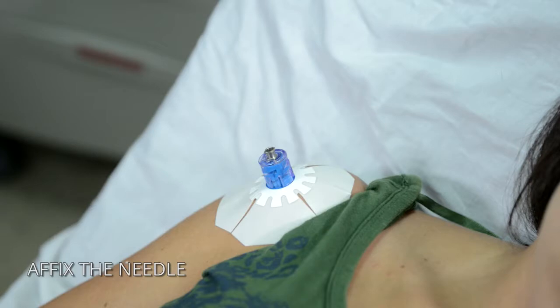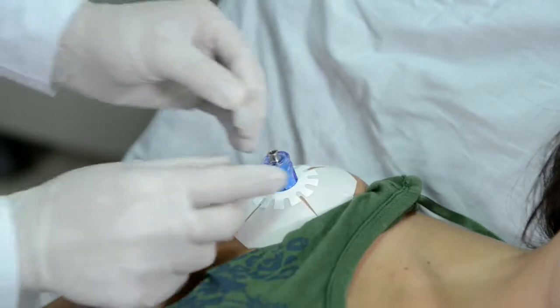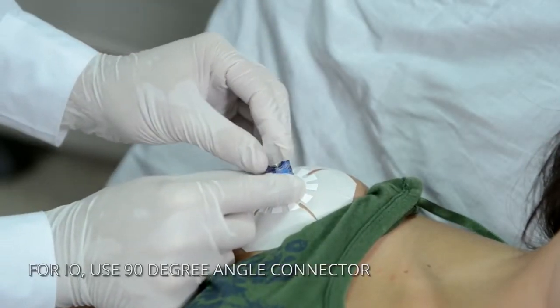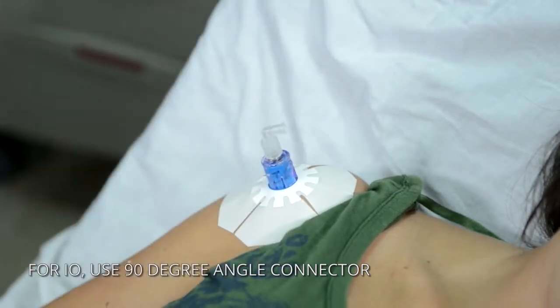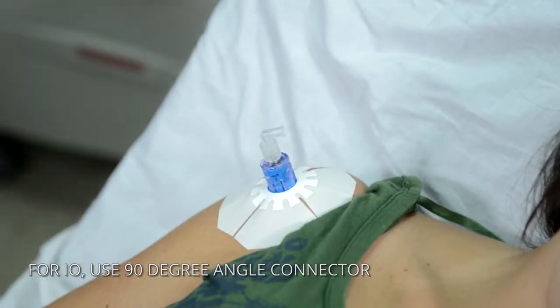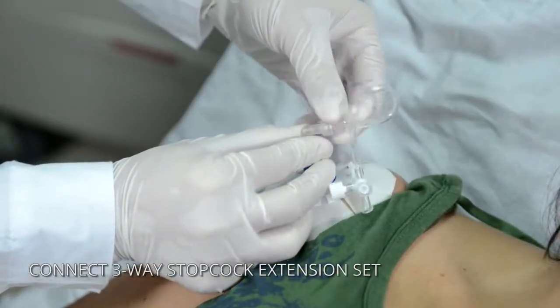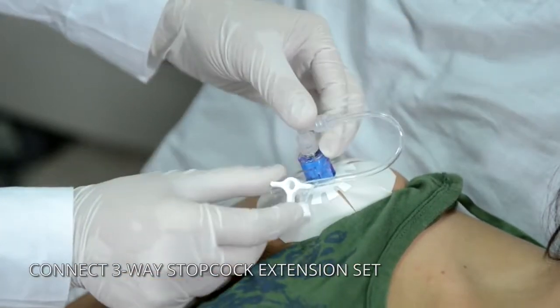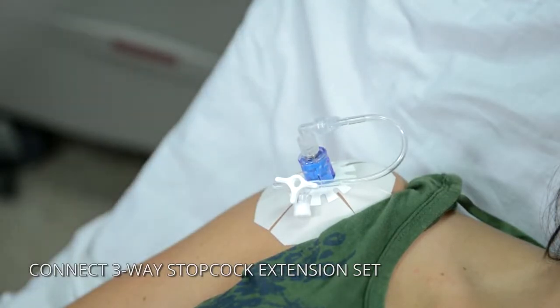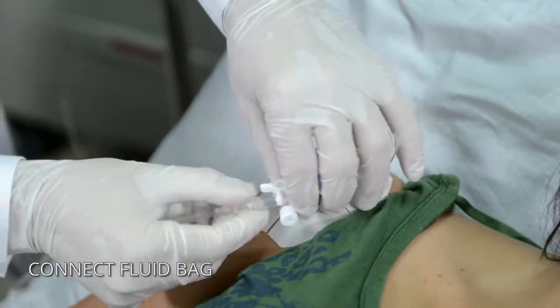Use the IO drill adapter when applicable. The Go IO has a unique extension set with a 90-degree angle luer lock connector, enabling the kit to work with both IO and IV lines. The extension set consists of a three-way stopcock, which allows simultaneous administration of medications, fluids, and blood products. This unique set prevents kinking of the line and allows for uninterrupted flow. Connect fluids and other items to the extension set as needed.